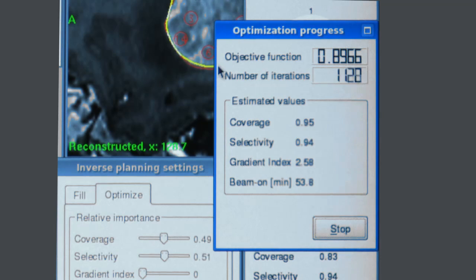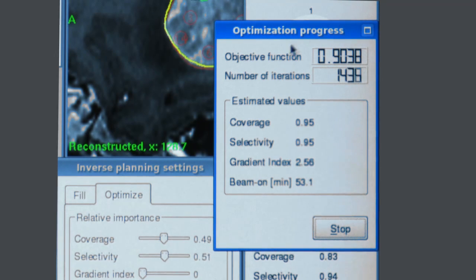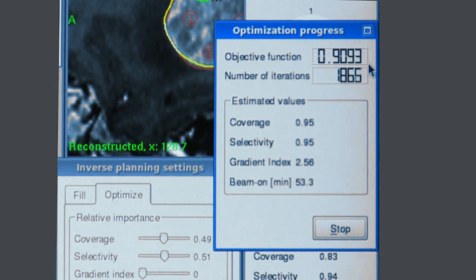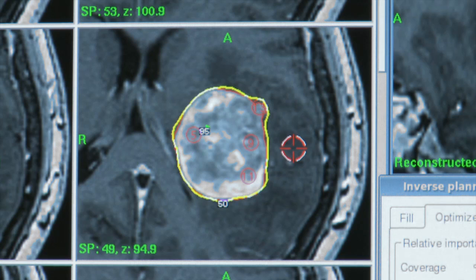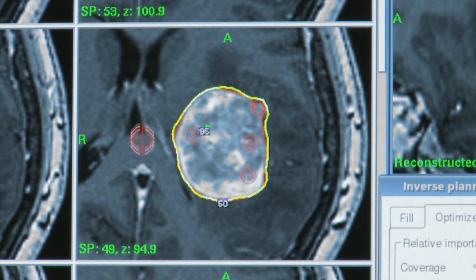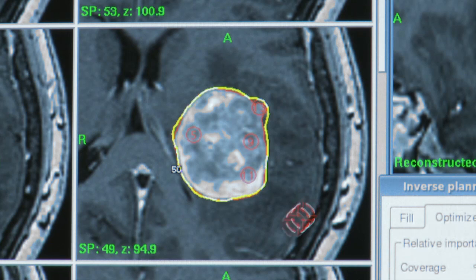This objective function here is giving us the Paddock conformity index, or new conformity index, for the treatment plan. You can see the treatment plan is looking extremely conformal now.